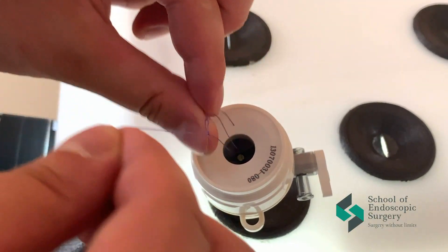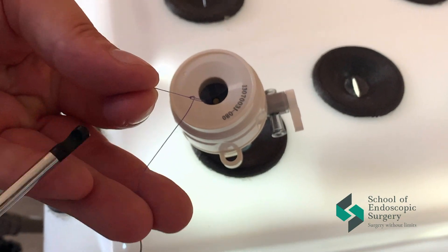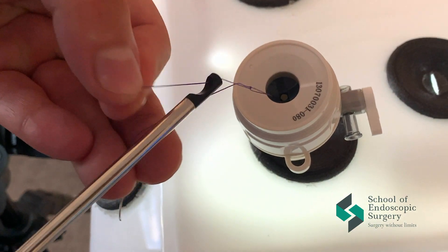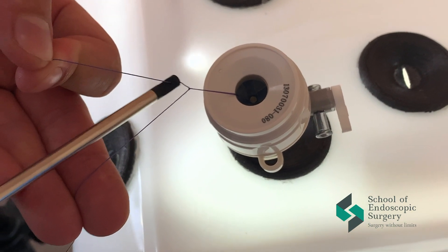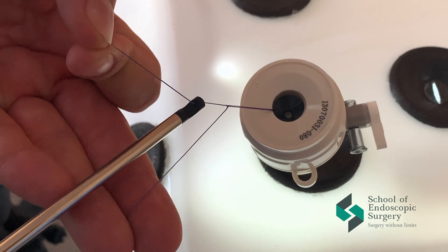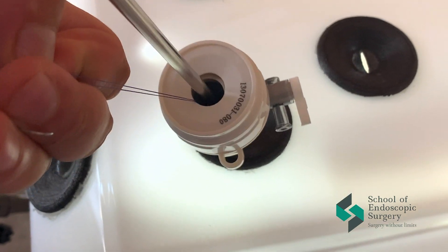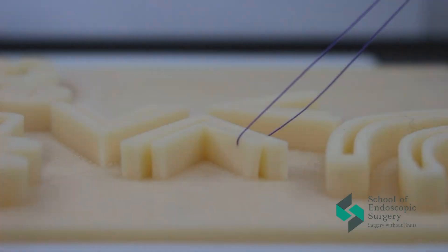Now you will see the first technique of forming a knot. Start forming a knot outside of the endoscopic box. One end of the thread pulls through the ring of the knot pusher. We hold the two threads by hand and use the knot pusher to pull down the knot.